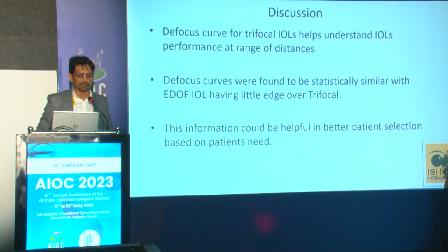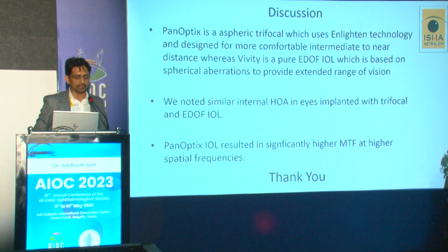Defocus curve is basically for presbyopia correcting IOLs, which helps in understanding the IOL's performance at a range of distances. Defocus curves were found to be statistically similar with both these IOLs. However, the EDOF IOL had a little edge over trifocal IOLs. This information could be helpful in better patient selection based on the patient's need. We noted similar internal higher order aberrations in eyes implanted with trifocal and EDOF IOL. However, Panoptix IOL resulted in significantly higher modulation transfer function at higher spatial frequencies.